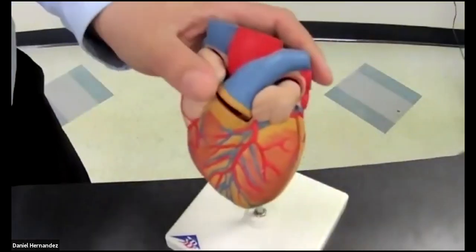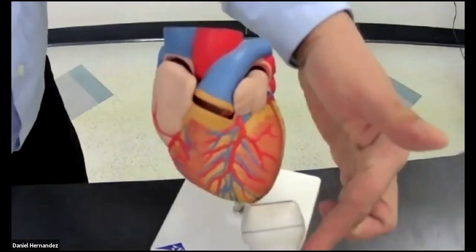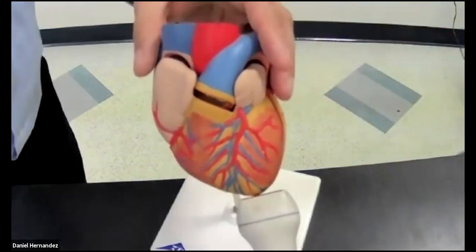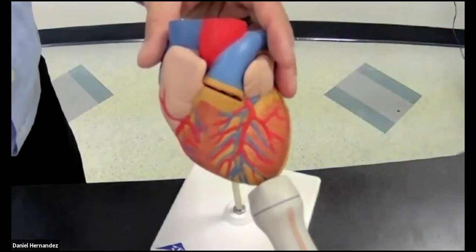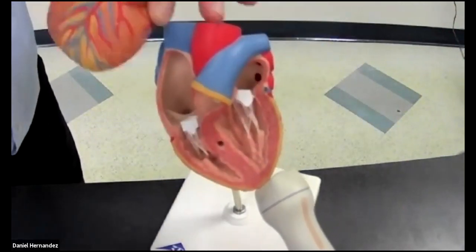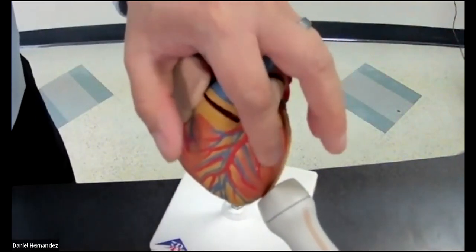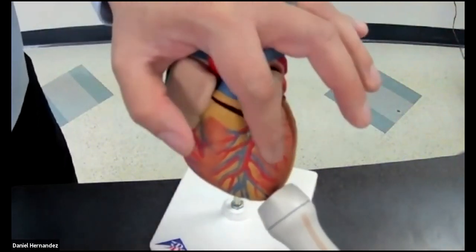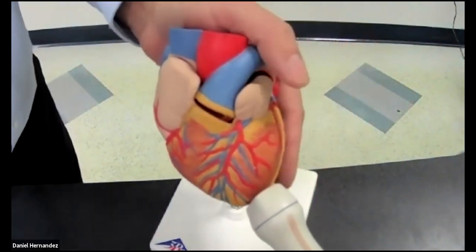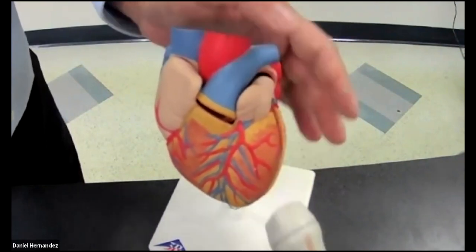If you go back to your model, you have your little notch, which is on this side of the heart. So this is lateral now in your 4-chamber view. Then you rotate counterclockwise, so your notch is now pointing up like 90 degrees, and you take it off. Now you have the front of the heart, anterior, where your notch is on the left side of the screen, and then inferior on the other side of the screen, the inferior portion of the heart behind the heart.